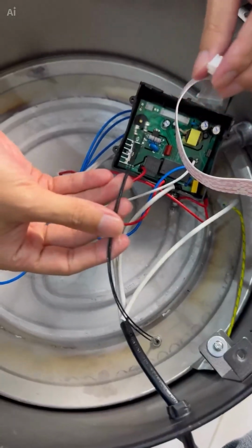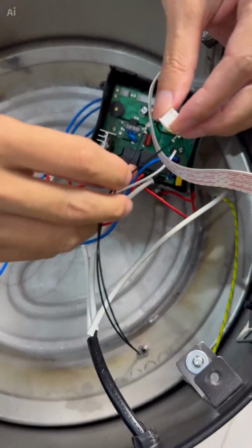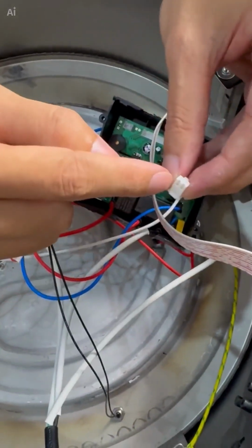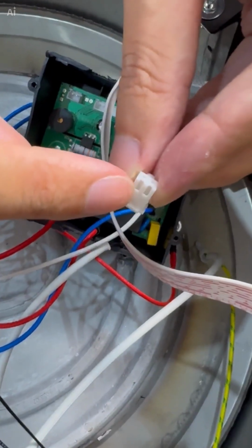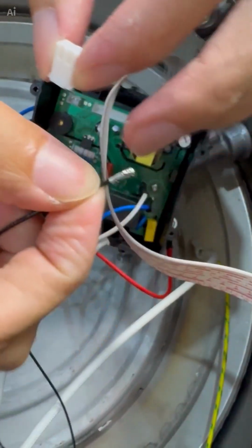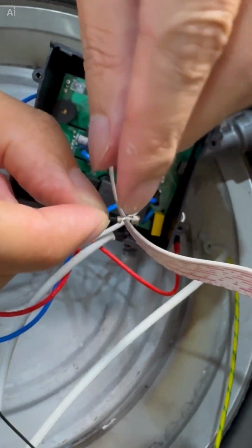The next step is to install this plastic terminal. It doesn't require direction differentiation. You can connect the two wires in any way. However, when connecting, be sure to find the side of the plastic terminal with the notch, with the notched side facing up, and then find the wire, this part of the wire, find the part with the protrusion. Here is the protruding part.